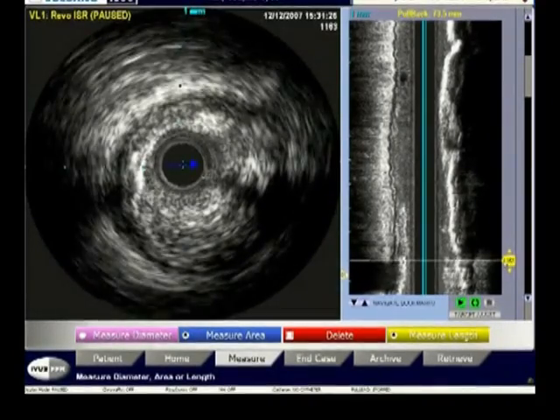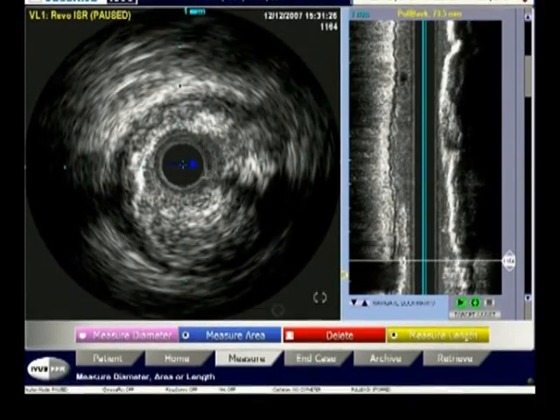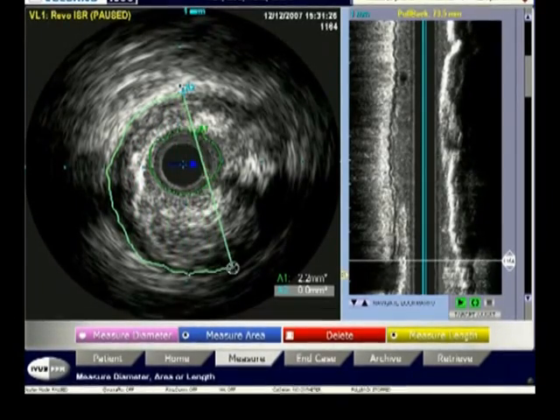I look forward to a live case tomorrow morning where the patient, Mr. Ramaswamy, has a 50-60% lesion in the proximal LAD artery, and he's also got a distal 85% stenosis presented to me with acute coronary syndrome. And what we are going to do is an FFR for the proximal lesion, and if the pressure wire and the IVUS show that there is huge plaque burden, we are surely going to go ahead and stent it.